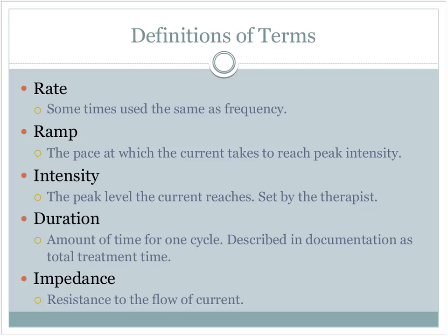If you're noticing that you're turning the unit up and it's a little bit excessive from where you would naturally have it, remember the number doesn't have to always match, but you're normally running at, say, 12, and now you're turning it up to 30, you go, well, okay, wait a minute, maybe something's not quite right. I usually do recommend cleaning off the area that you're providing the e-stim to.